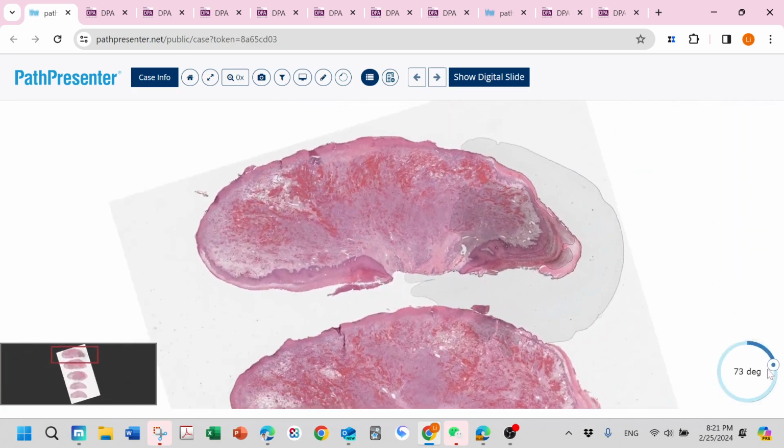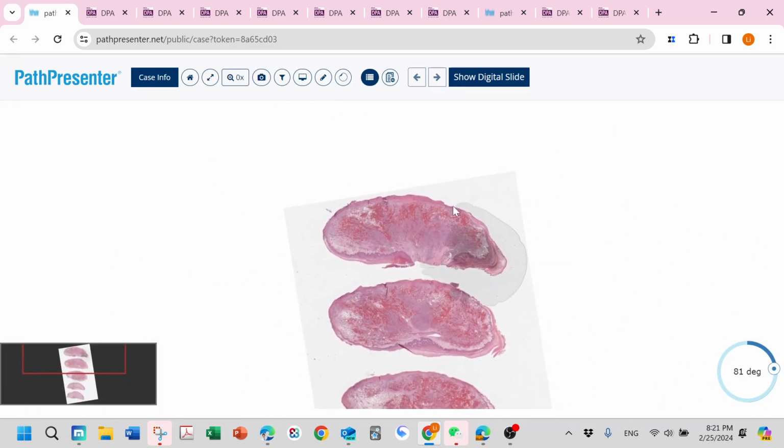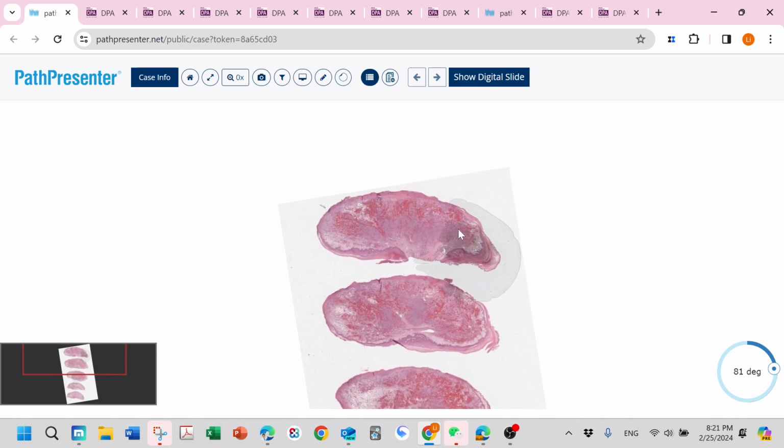We have another lesion, another nodule growth, usually in the extremity. And then in the history, you will find an immunocompromised HIV patient. And then there are different stages for this lesion. This is Kaposi sarcoma. Different stages. This is forming a nodular tumor stage of Kaposi.